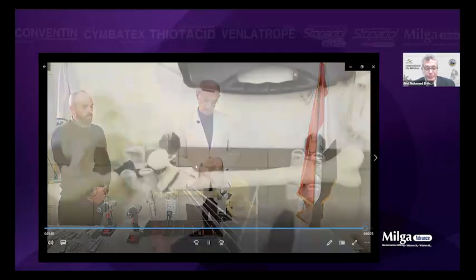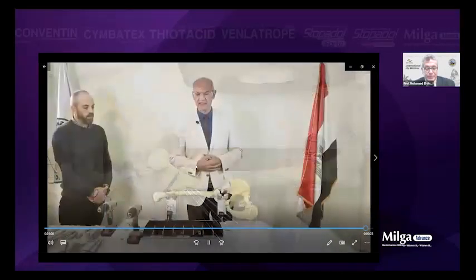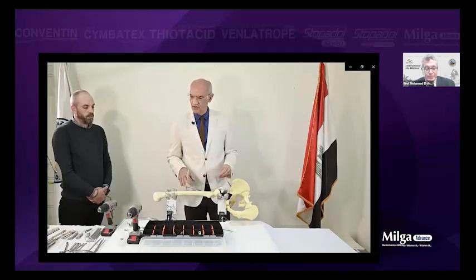It's all closed. You start the operation with the fixation of the fragments with 5 methods: serrated wire technique, half pins in the direction of the neck, cannulated half pins in the direction of the neck, half pins or Schanze screws in the direction of the DCS, or you can apply also supraacetabular fixation. Proximally, it's easy and there's no problem. After you finish, you apply the frame, any frame you want. I'm not going to talk about circular fixator or unilateral fixator or Ilizarov or whatever you want, any type of fixator you want. Thank you.